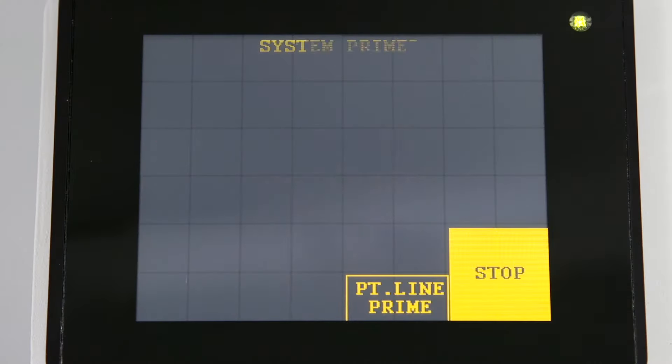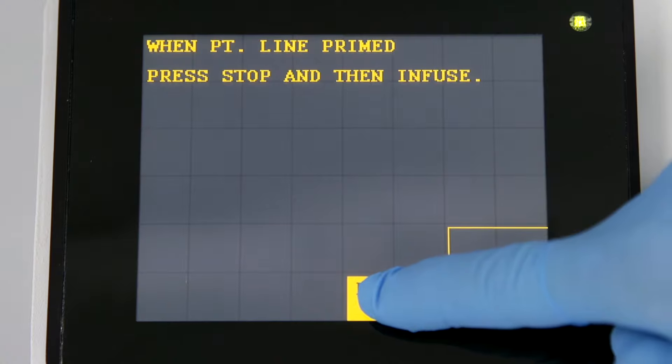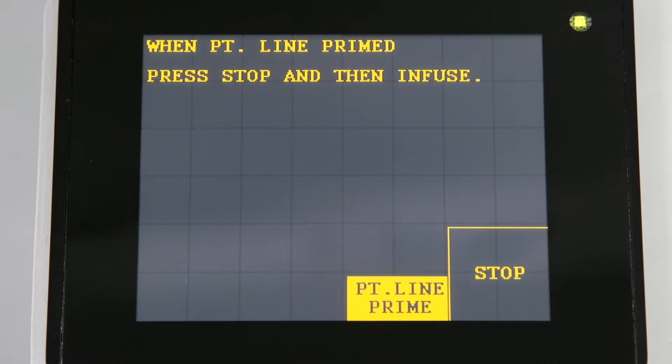The next screen will prompt you to prime the patient line. Press the patient line prime key once to prime at 50 milliliters per minute, or press and hold the prime key to prime at 200 milliliters per minute. Press stop after you have confirmed all air has been purged from the patient line.